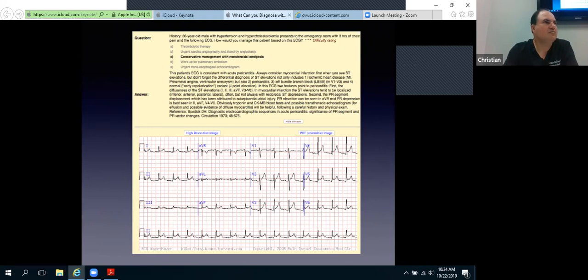Yeah, with myocarditis as well. So right. He got admitted. He was 25. He looked great. Myopericarditis is something to look for. You look for it to see if they have an effusion too.